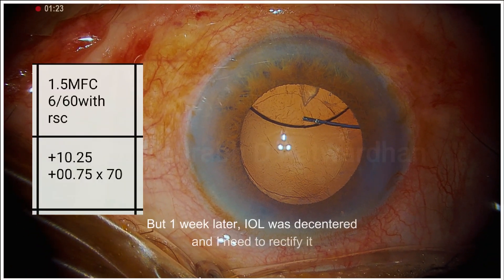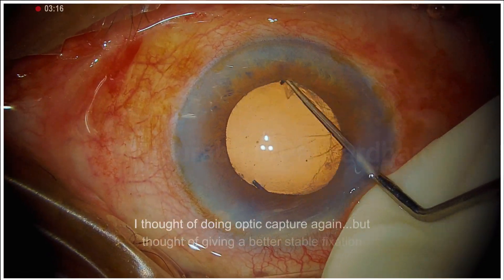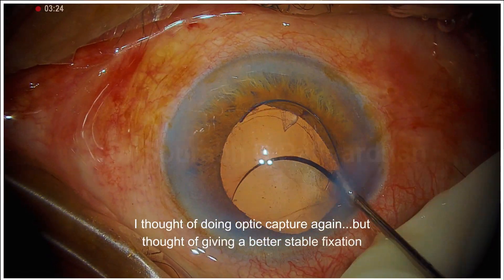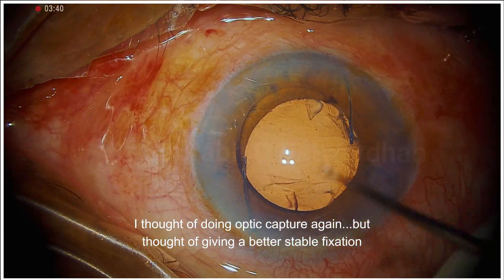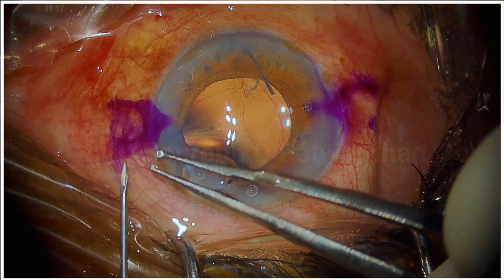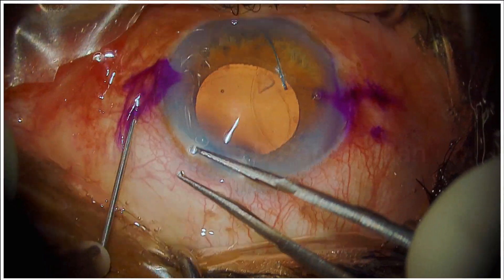After one week, the patient comes back and you can see the IOL is decentered. As I was suspecting during the surgery, the inferior sulcus is lost. Should I just do optic capture again? No — I thought let me give a better solution to the patient.